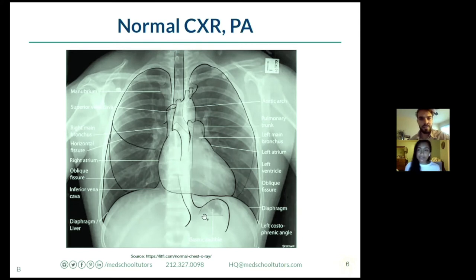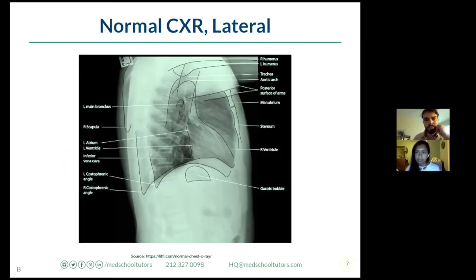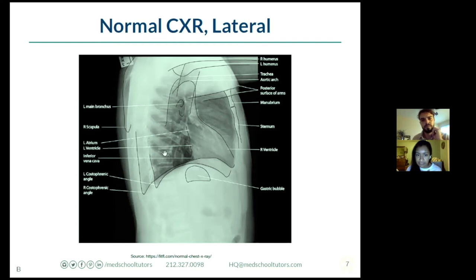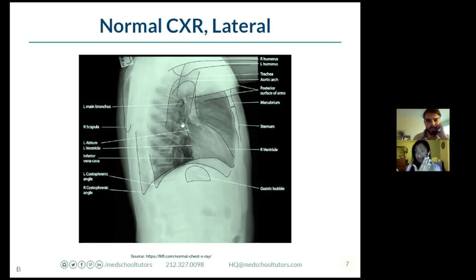The laterals are much less commonly seen on exams. Going through the anatomy briefly: this is where the heart is, here are the vertebral bodies, this is the aortic arch, and here is where the trachea comes through. This is approximately where the hila are and they're overlapping, so you can't really differentiate which is left and which is right - one of the difficulties of x-rays.